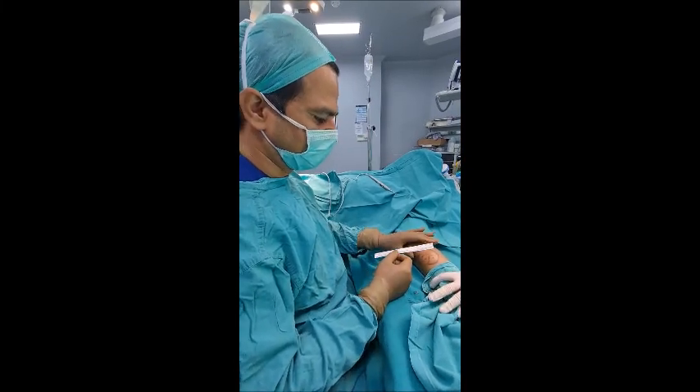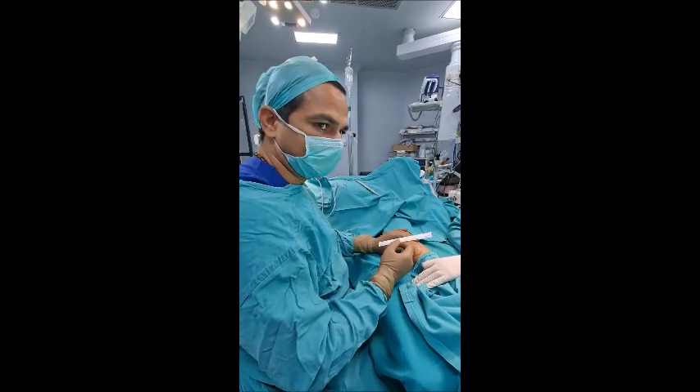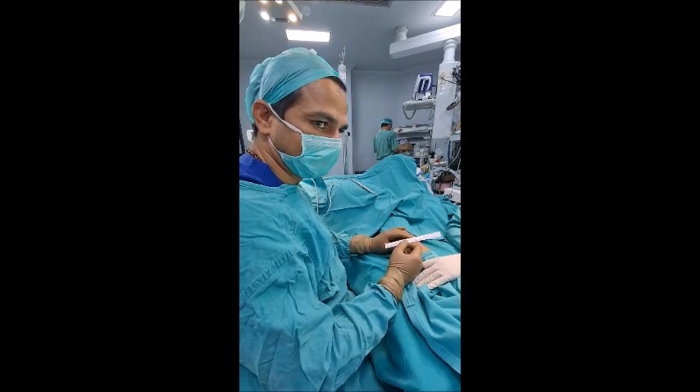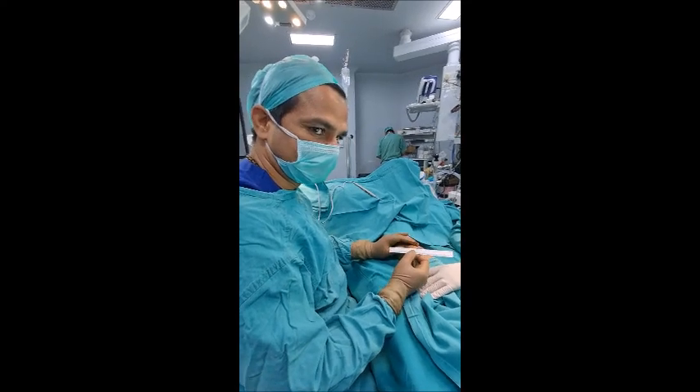The great point about this is the complete lipoma is out — no wound is there which requires stitches or anything. When there is no big wound, recovery is very fast. The patient is up and about the same day. He can start driving and can start working the same day.